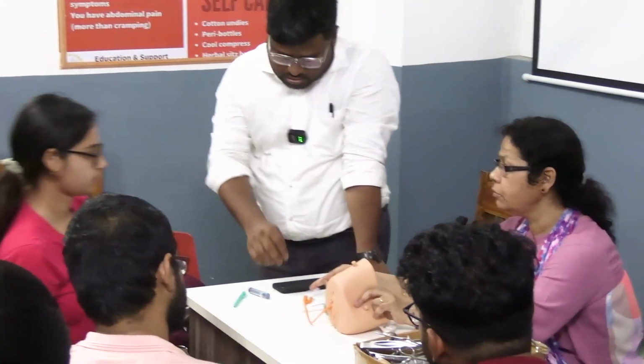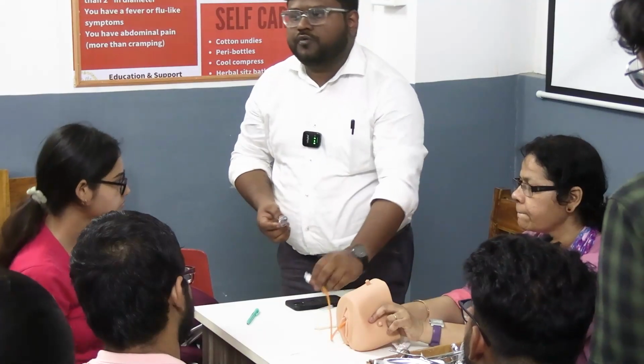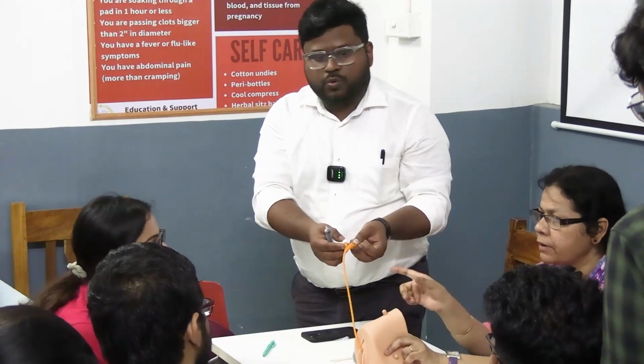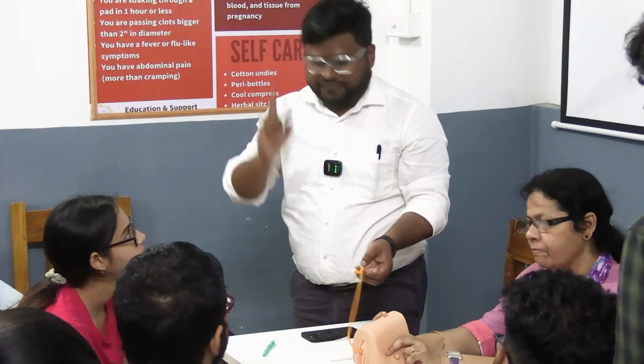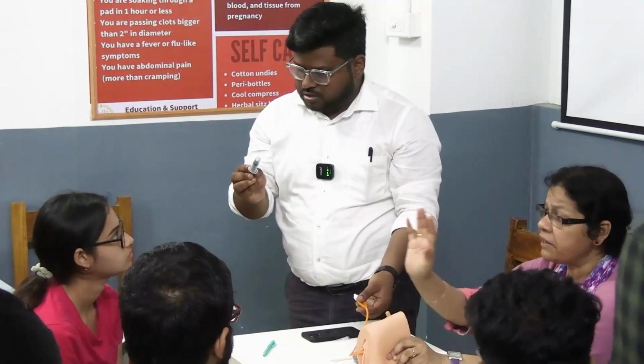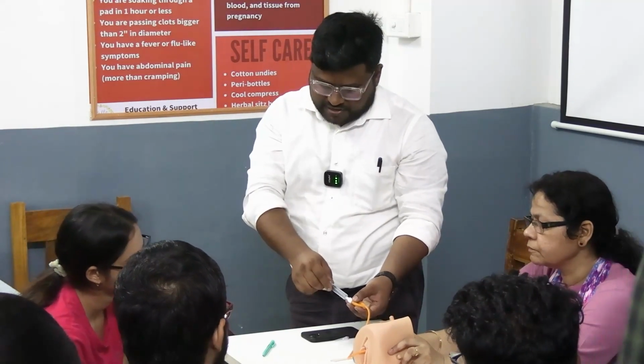It went in? Now you will inflate the balloon. The amount you inflate is written here. See? What was the amount written here? 5 to 15. So the balloon capacity is 5 to 15 ml. So you're going to inflate it with 5 to 15 ml of normal saline. At least 5, and not more than 15. This is a 5 ml syringe. I'm inserting 5.